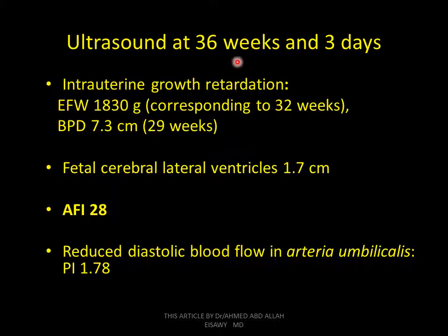Ultrasound seen at 36 weeks and 3 days. Intrauterine IUGR and fetal cerebral lateral ventricles 1.7 cm. Amniotic fluid index 28, reduced diastolic blood flow in the umbilical artery. 1.78. This is the pulsatility index.